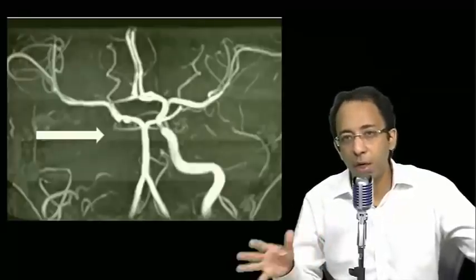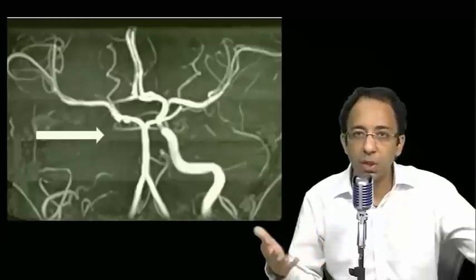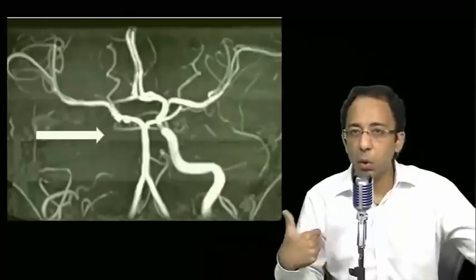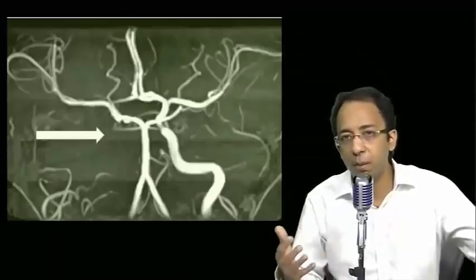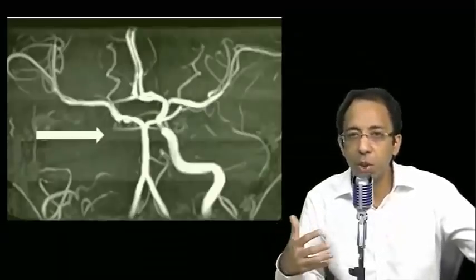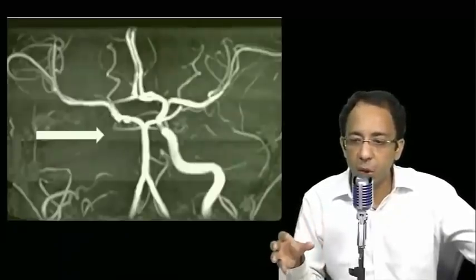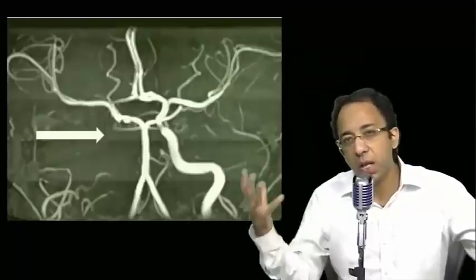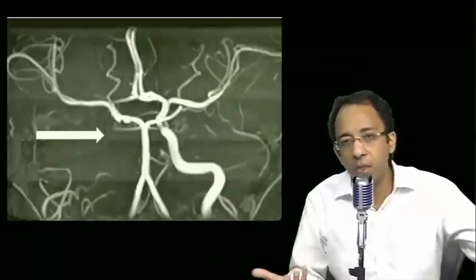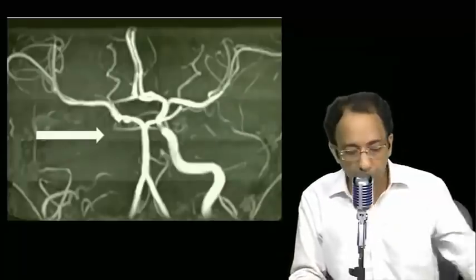So this is the overview I wanted you to look at, and the broad 2-3 messages that I wanted you to have is MRI is better than CT because we can look for cerebral as well as orbital involvement. And I told you the rationale and logic behind the black turbinate sign. Why do you have a black turbinate sign in mucormycosis? It is because the fungus is angioinvasive, and the fungus leads to infarction and the gangrene of the tissue, and it does not take up the dye, and it remains dark on a contrast enhanced MRI. Are you clear, everybody? Okay.